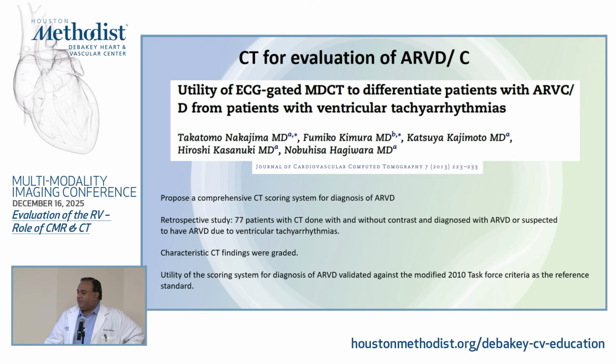And they came up with a few different CT findings, which I'll show you on the next slide, that they graded. And then they tried to compare the utility of the scoring system on CT that they were proposing against the 2010 task force criteria as the reference standard.